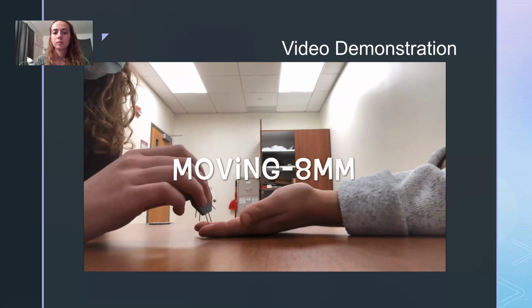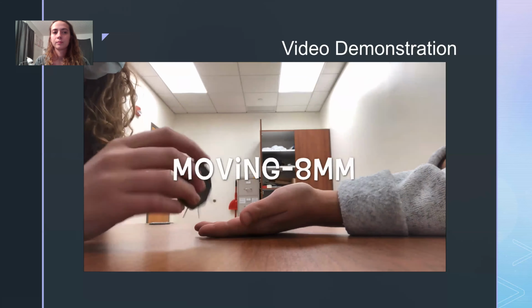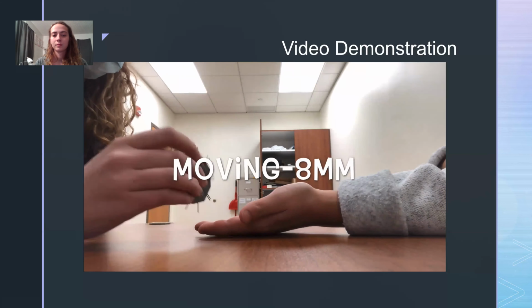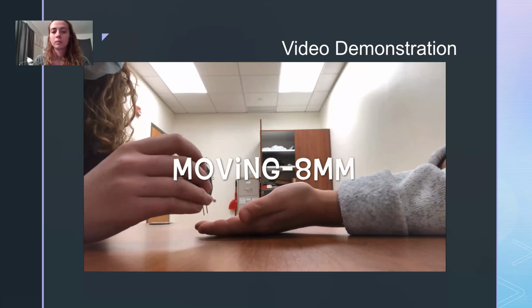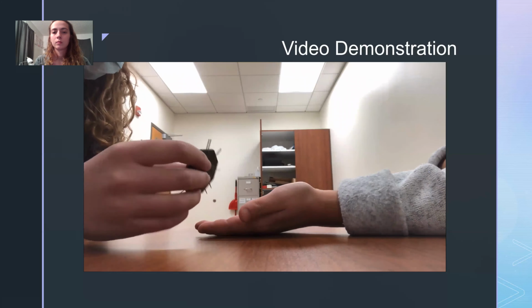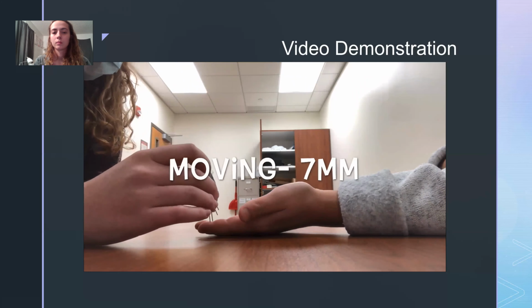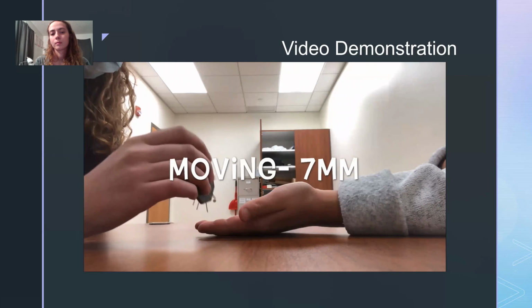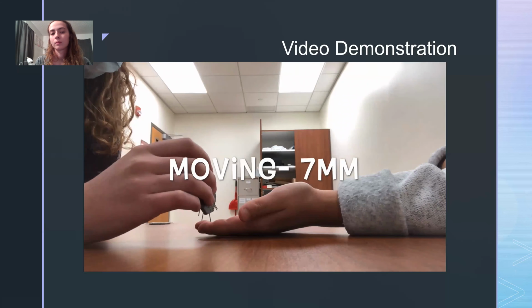2, 2, 1, 2, 1, 2, 1. Alina continually got the first 7 responses correct, so I continued to decrease the distance for the moving test. Note the position of the discriminator tool compared to the static test. The prongs are now perpendicular to the long axis of the finger rather than being parallel.